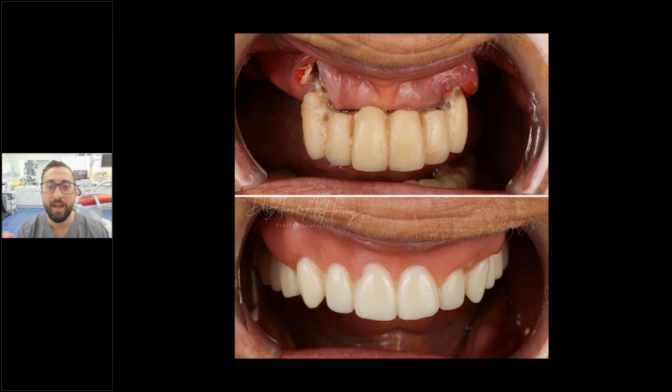This patient came in looking like this, the top picture, and she needed a denture. She was traveling somewhere. Of course, patients always come last minute, and this denture could be printed within 1 week. And if you were pushing it, you could do this within 24 to 48 hours. And these are the sort of workflows that are just mind-blowing, and you can't beat that with analog.